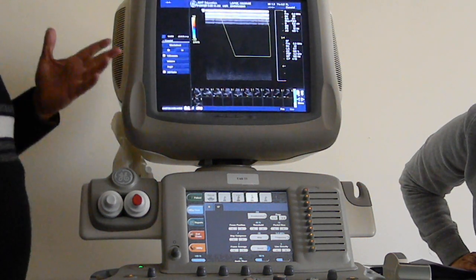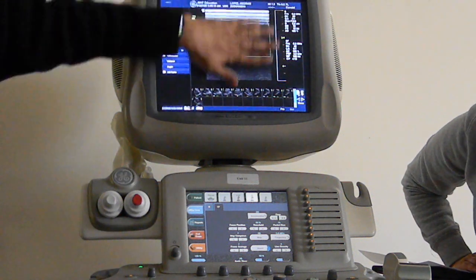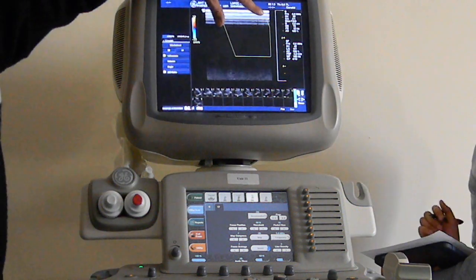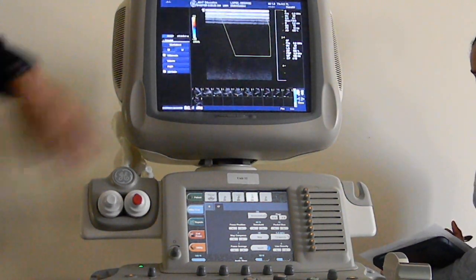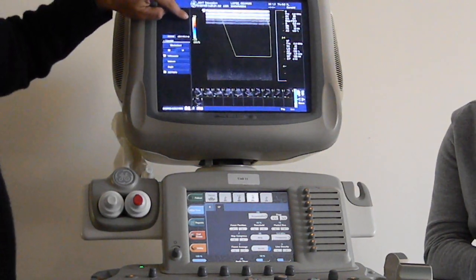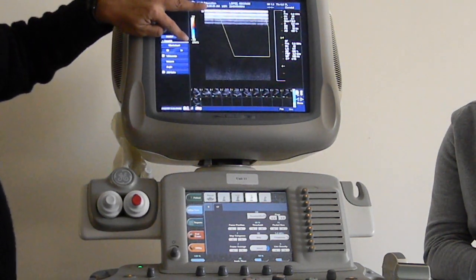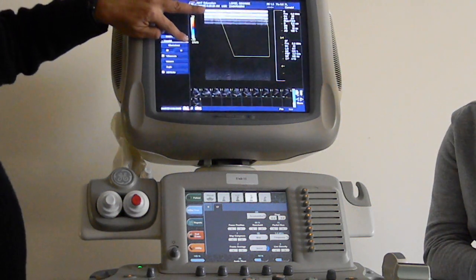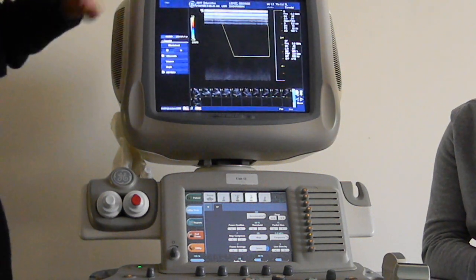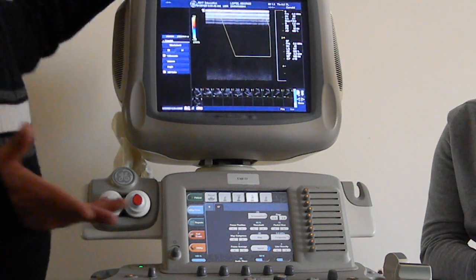Okay. Now a couple of things that you might have seen changed. Your B mode screen now has a box. Another thing that you saw is that the plain, boring, basic gray map became colorful. We're going to talk more about these maps in ultrasound physics.